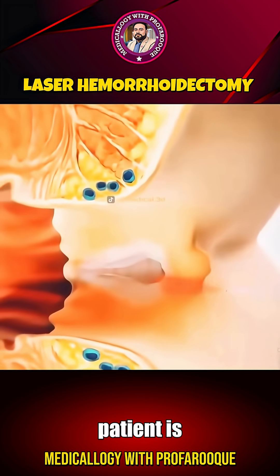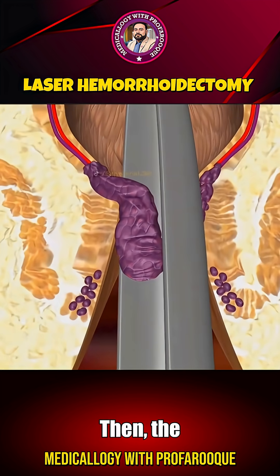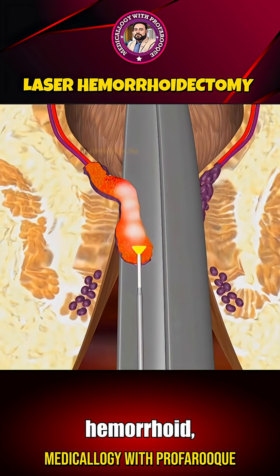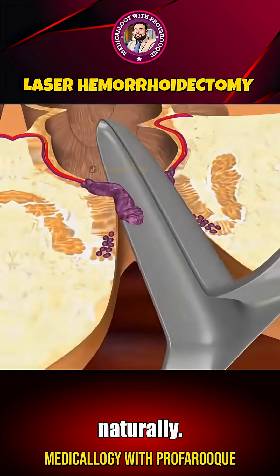During the procedure, the patient is first administered either local or general anesthesia, depending on the case. Then, the surgeon carefully inserts a laser probe and targets the hemorrhoid. The laser energy precisely cauterizes and seals off the blood vessels supplying the hemorrhoid, causing it to shrink, dry up, and eventually detach naturally.